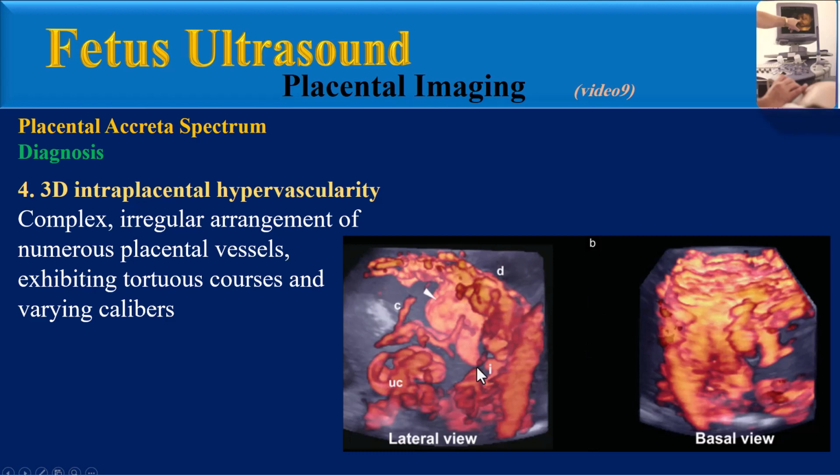During serial examination, part of the intervillous circulation and abnormal lacunae merged together to develop a large aneurysm. This basal view showing numerous dilated vessels fused and extended to the whole placental bed. These coherent vessels, along with huge aneurysm, developed an extensively vascular complex over the serosa-bladder border.